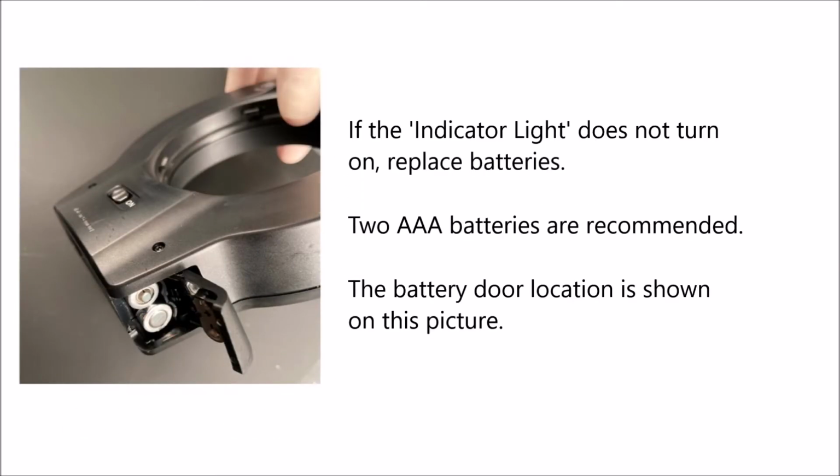If the indicator light does not turn on, replace batteries. 2 AAA batteries are recommended. The battery door location is shown on this picture.